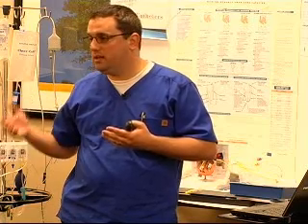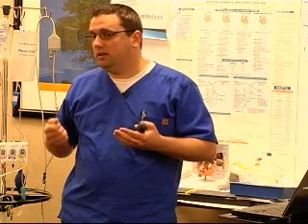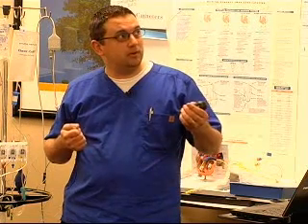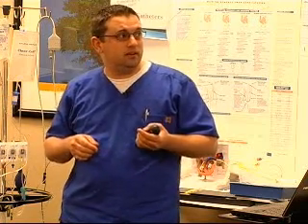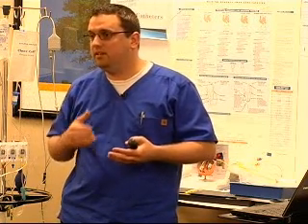If you move the catheter at any point more than 5 centimeters, whether the physician or practitioner advances it, or if we pull it back more than 5 in any instance, or if you had to refloat it and pull it back to a CVP position, meaning you had to pull the catheter all the way out to where you see that initial CVP tracing like you did when we were putting it in, that would be another indication to get another chest x-ray. My point is, anytime you move the catheter 5 centimeters or more, you really need to get another chest x-ray.